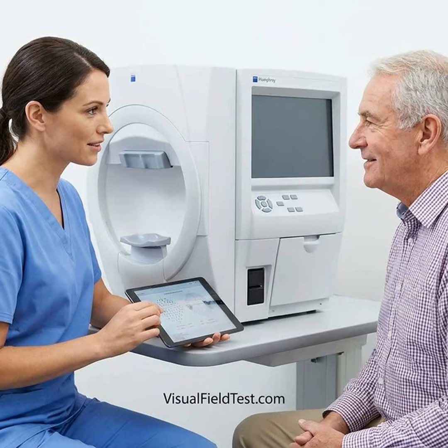Step 4. Use teach back. Ask the patient to explain the procedure. Correct misunderstandings before testing begins. Step 5. Offer a brief practice. A short, non-diagnostic practice sequence can familiarize the patient with the button and the changing brightness of the lights. The practice results should not be used as the patient's clinical baseline.